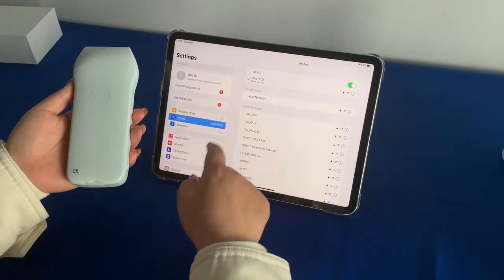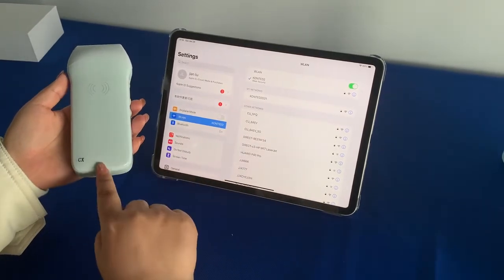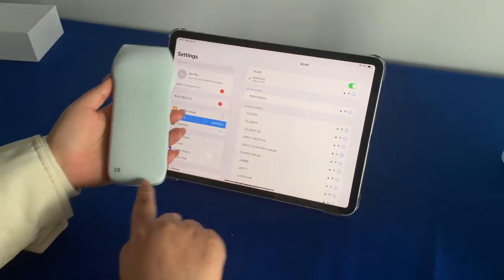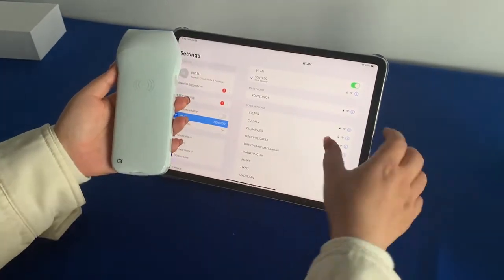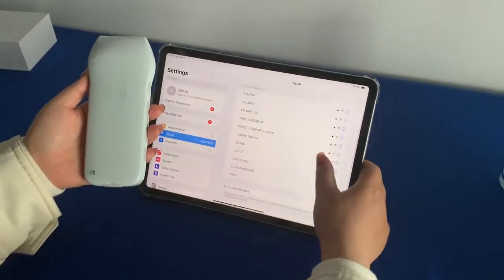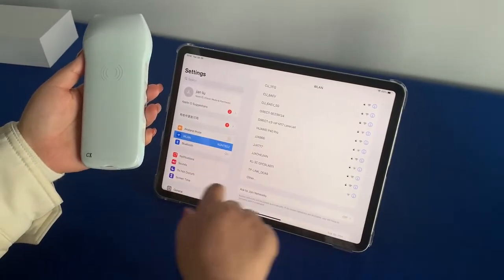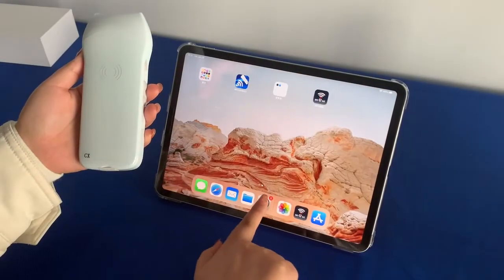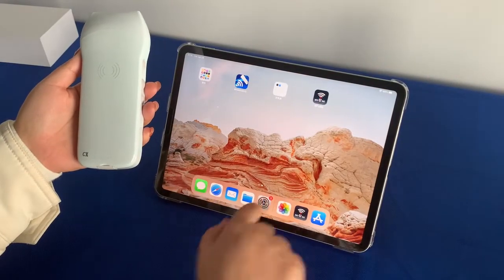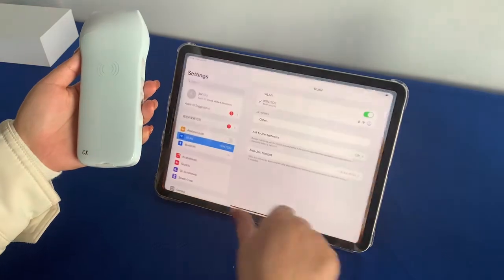Firstly, we connect the Wi-Fi. This is the Wi-Fi name. We can find the Wi-Fi in the setting, in the iPad setting.